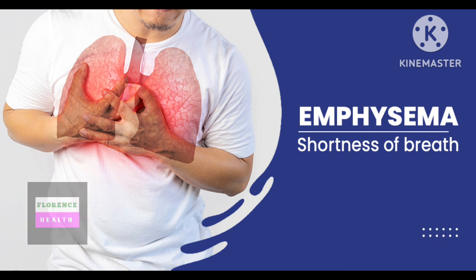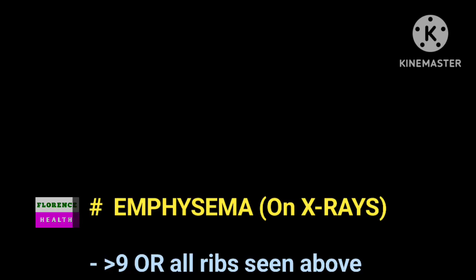Now we have to discuss how to recognize emphysema on chest X-ray. Clinically, the patient will present with difficulty in breathing, shortness of breath due to decreased oxygen saturation. Now we have to discuss what are the X-ray features of emphysema.